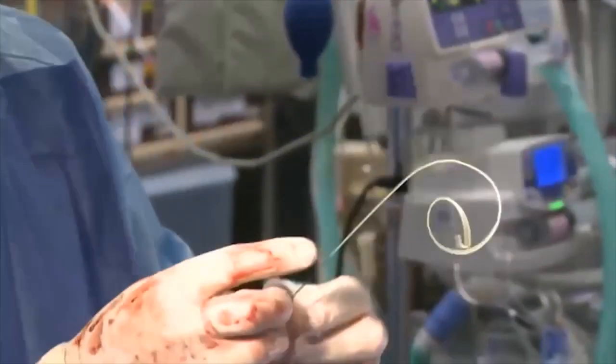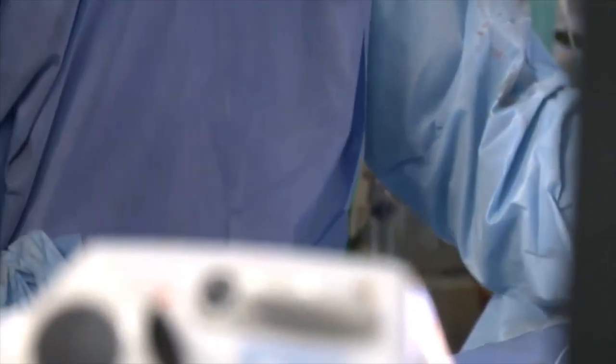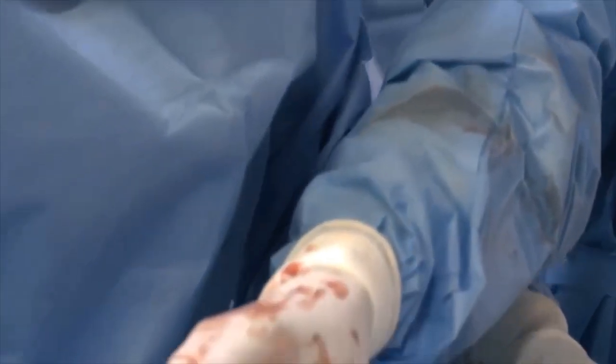Of course, this is the usual technique which we use for most of the patients. I want to change it to a pigtail now. Pigtail is not in. No. Okay, I want a regular wire. So come to RAO, please. Yeah, regular exchange length wire.